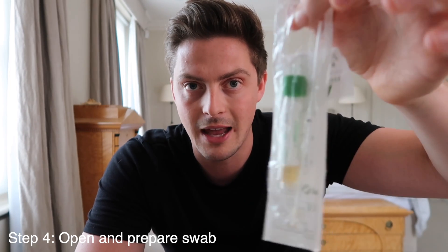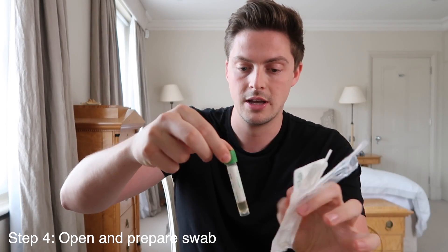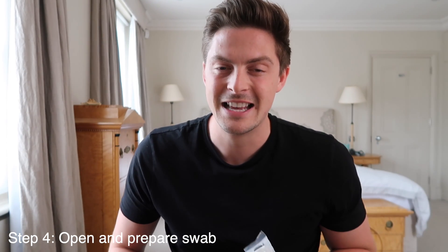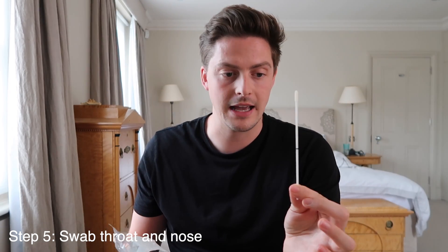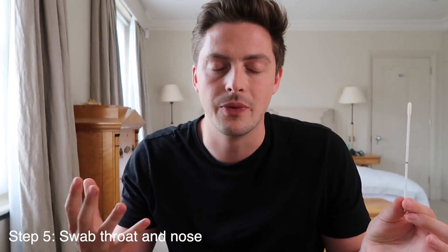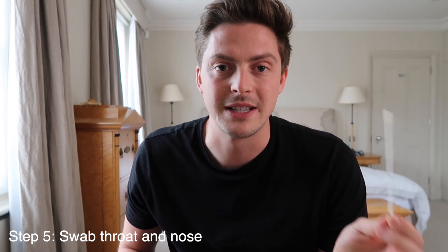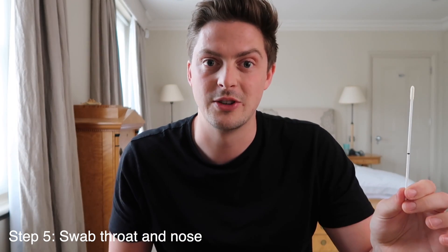Take the container out very carefully without touching the swab end, take off the lid and set it aside. Try not to knock it over — if you do, you'll have to reorder a test kit. Now for the tricky bit: hold the base of the swab, take it out of the pack, and don't let it touch anything else. Open your mouth wide, look in the mirror, and swab the tonsils only. Don't touch your teeth or gums as bacteria there can affect the result. Swab both tonsils for about 10 seconds, or do five rotations on each.